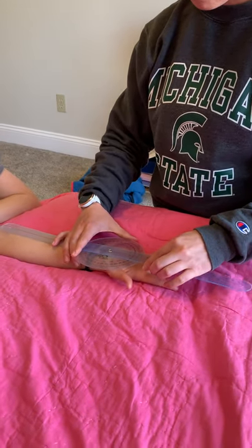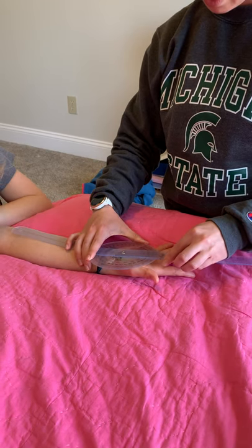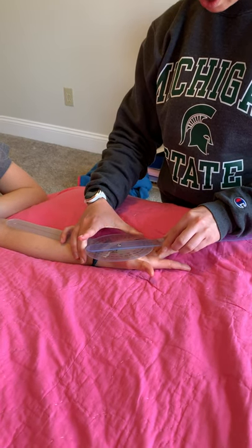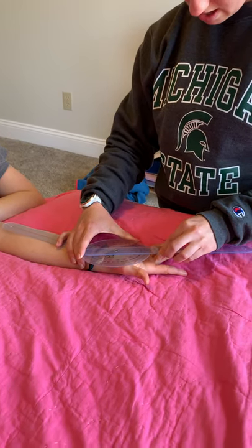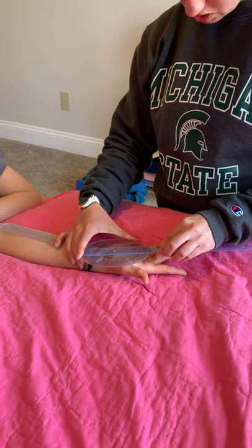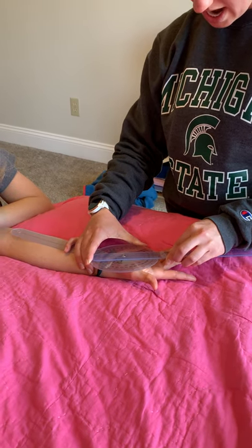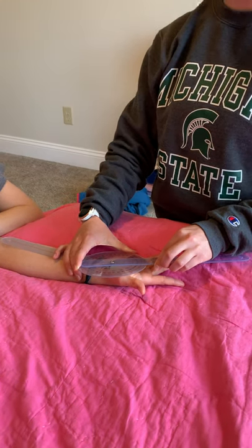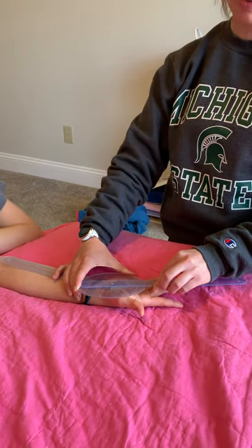And go ahead. We are at 26 and a half degrees of ulnar deviation.